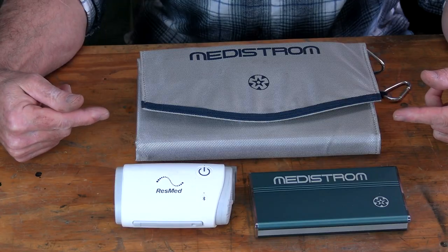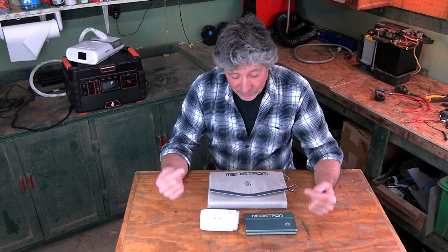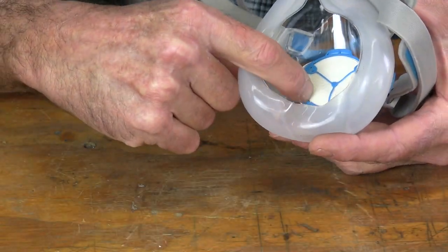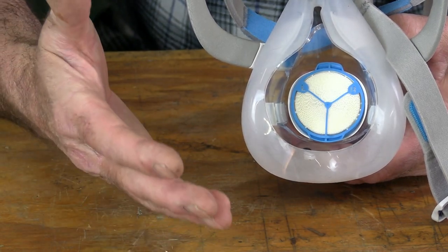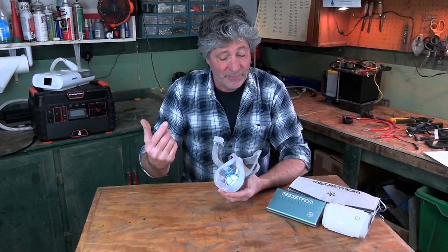So these three components will allow me to stay out in the middle of nowhere indefinitely, and are small enough to pack and light enough to carry. Lofta also offers the usual hose, headgear, and masks — I use a full-face one. Now, back to how this unit humidifies the air: this replaceable porous disc in the mask collects moisture from your exhale, and that moisture is released when you breathe in, basically recycling your own body's water vapor. I was skeptical of this, but it definitely works.